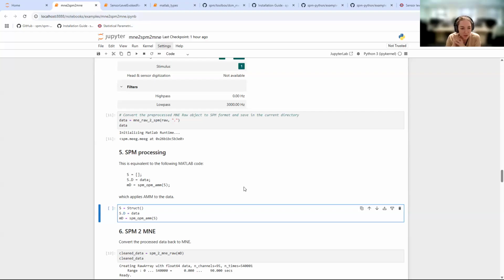I think there was a bit of a caveat about how it translates gradiometers, but the data is saved, everything is good. It's just the annotation is a bit weird, but I'm working on it. Other than that, it literally just creates the object, taking information from the MNE raw object and translating it to the object. That's it. Not a big magic there, but still cool.